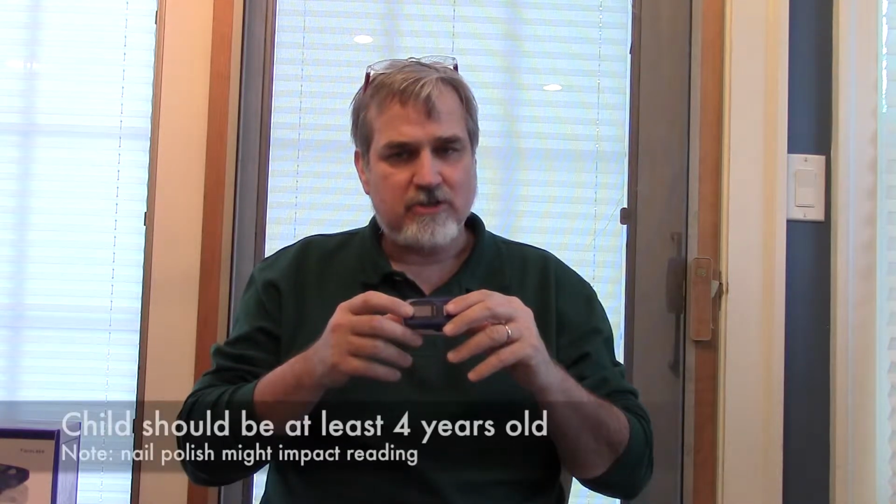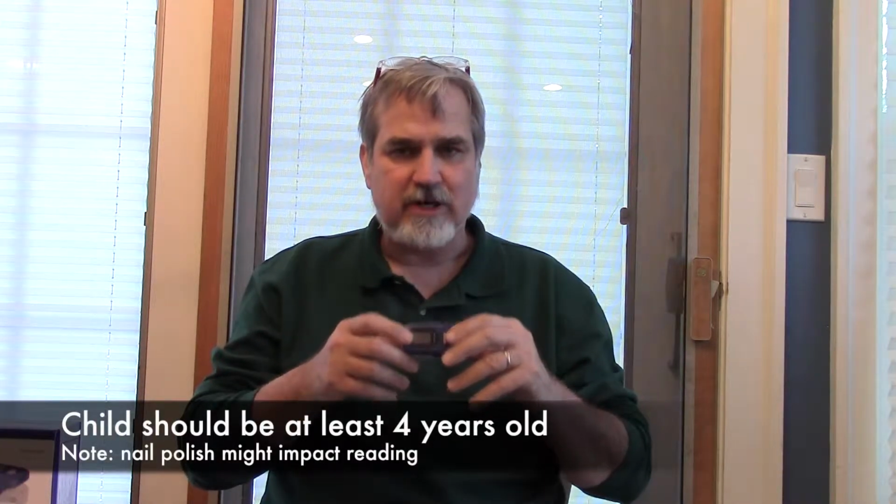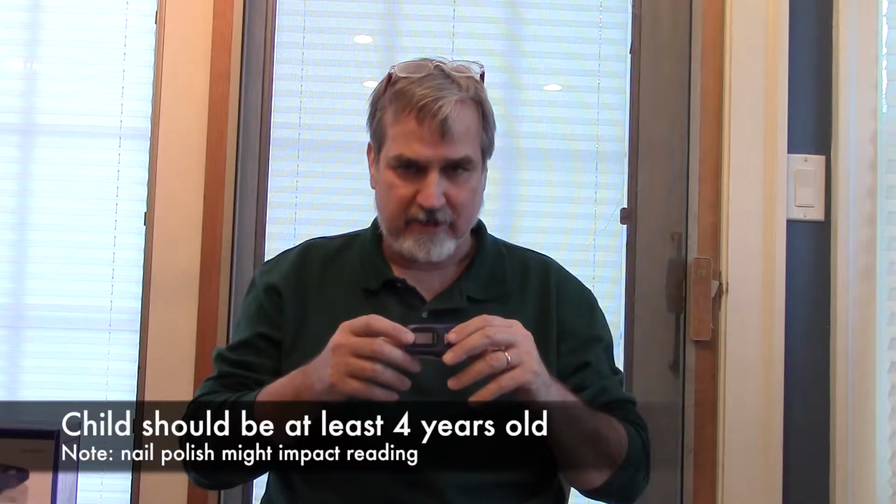The key thing is when somebody uses these, the child should be over 4 years of age and there should be no nail polish on their fingers. That will affect the reading. So when you do one of these, you take your time. It's very helpful to know their response to treatment, how much the oxygen level went up, and also when you call the office to give an oxygen level.